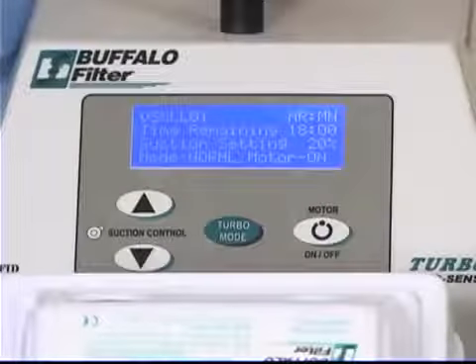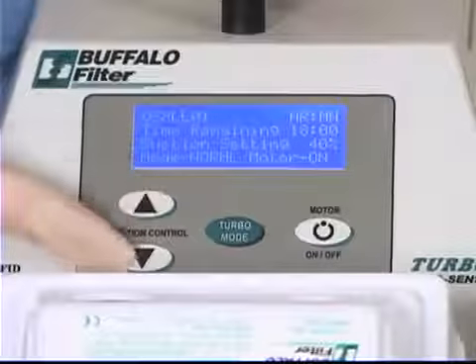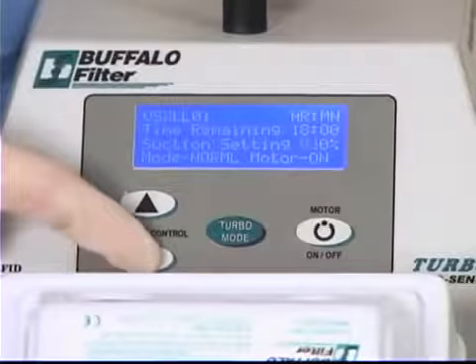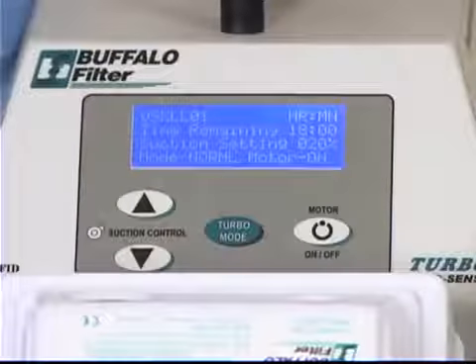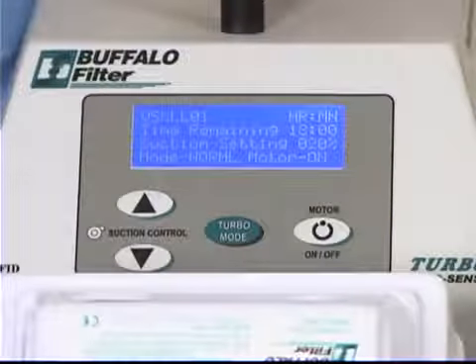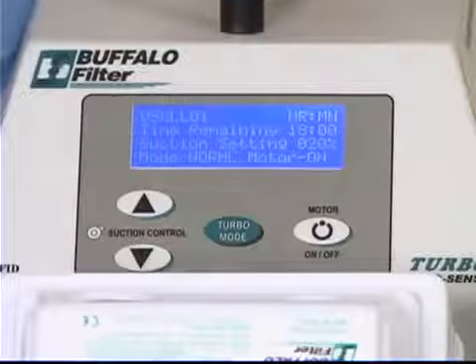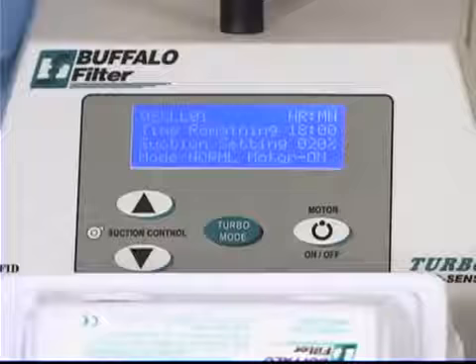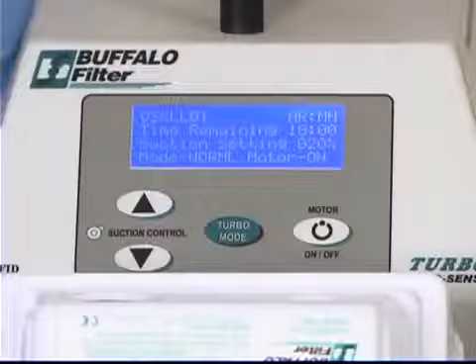Suction or motor speed can be adjusted using the up and down arrows on the unit's control panel. It is recommended that a suction speed be selected that is sufficient for capturing the plume created, but it is not necessary to set the suction speed beyond this level. Using a suction speed that is just sufficient to capture the smoke plume will allow the facility to further take advantage of the Whisper Turbo AutoSense's already very quiet design.